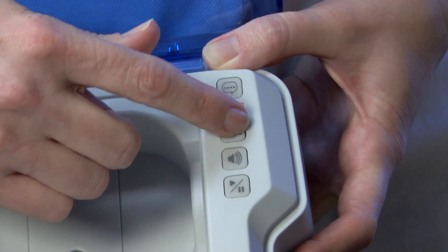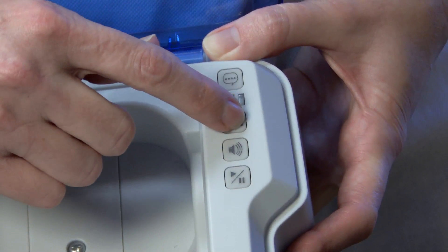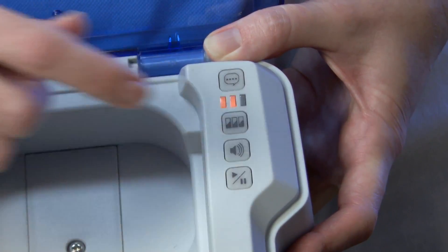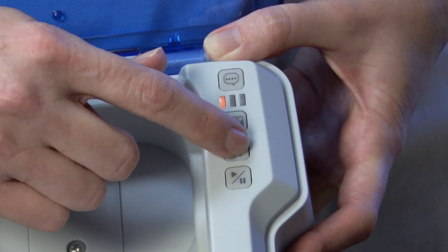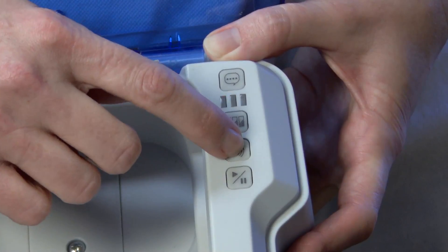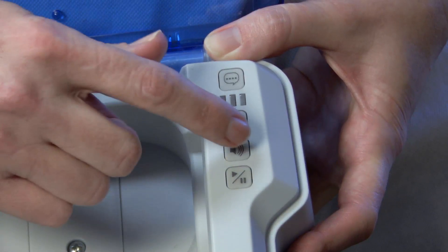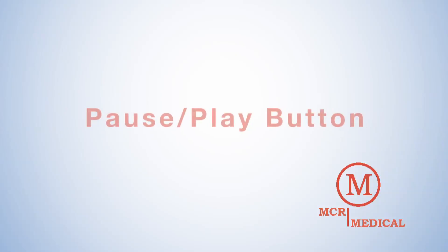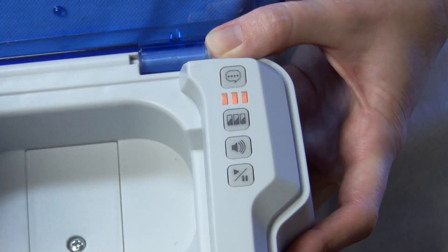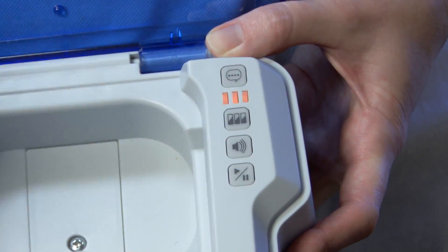A red light on the selection indicator light section means shock; yellow means no shock. The default is three cycles of shock. The Volume button: there are three volume levels on the unit. By repeatedly pressing the Volume button, you can increase or decrease the unit's volume. Yellow lights show low, medium, or high volume, with one, two, or three lights illuminated in the selection indicator lights section on the unit. The Pause/Play button: when the Pause button is pushed, the unit will pause the scenario. When in Pause mode, three yellow lights in the selection indicator lights section of the unit will blink.